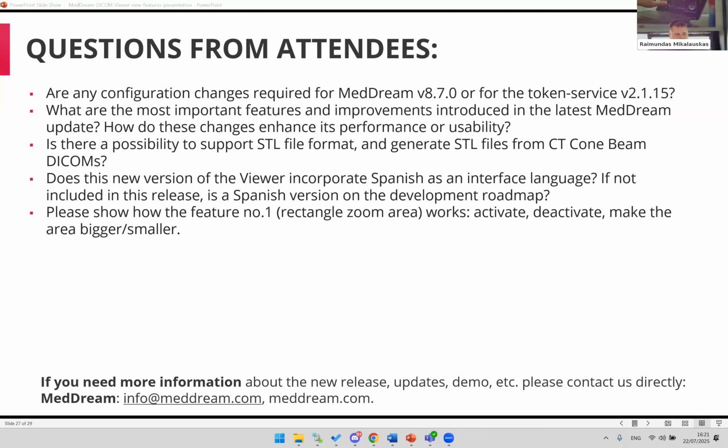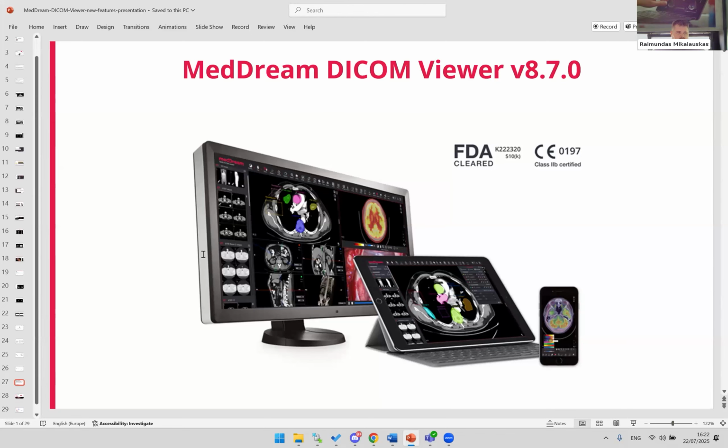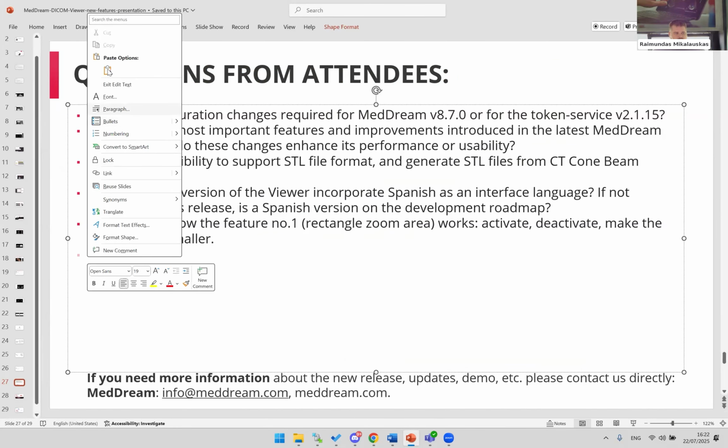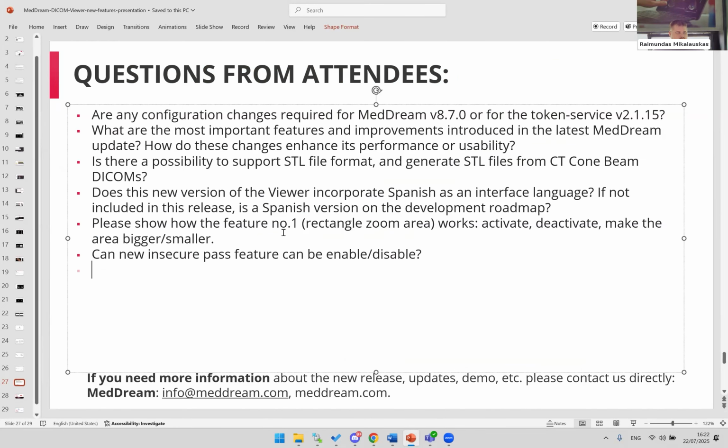With each version, we run performance tests, and the version is not slower than previously, so performance is not affected. Usability, we are always improving it and adding new things. So I hope with your help and your needs, we will make our product better.